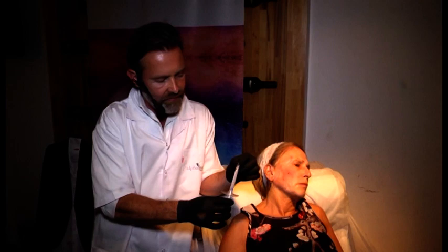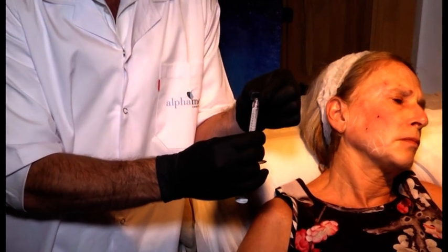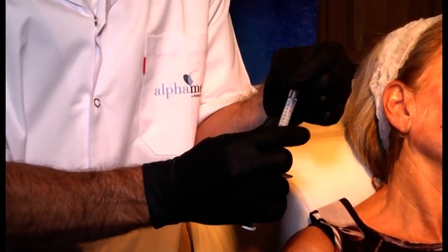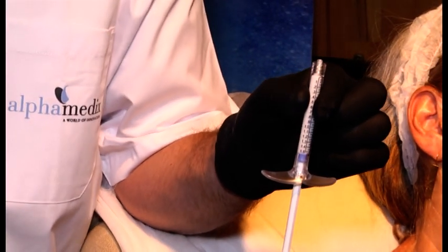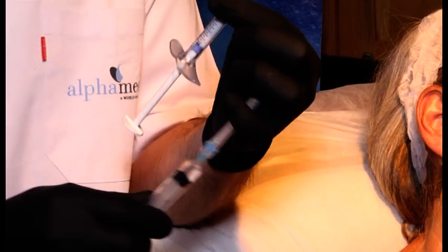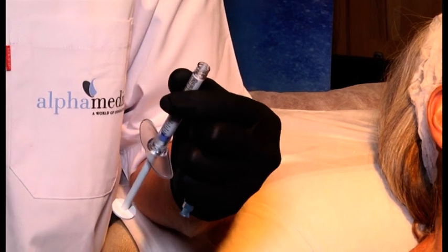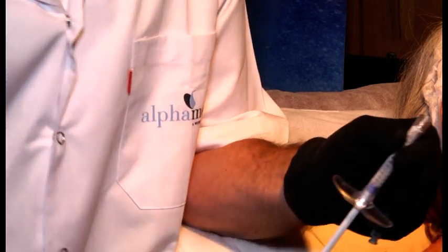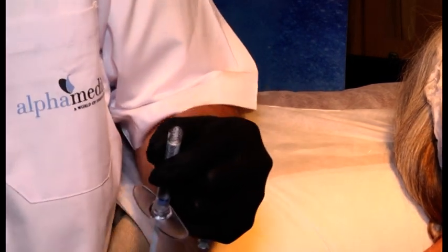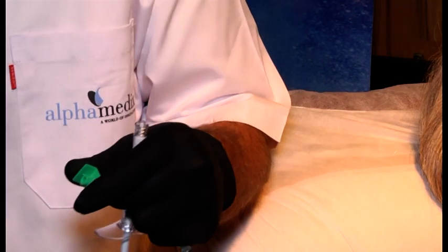Okay. This is 1 syringe of Radiesse. It has the clear cap, which means it is the classic Radiesse. The classic Radiesse, the Radiesse which has no lidocaine inside. Then, what is this? Saline, 1 cc. All right. Can you give me another syringe of this? With lidocaine, 0.3? Okay, because it has a little bit less.